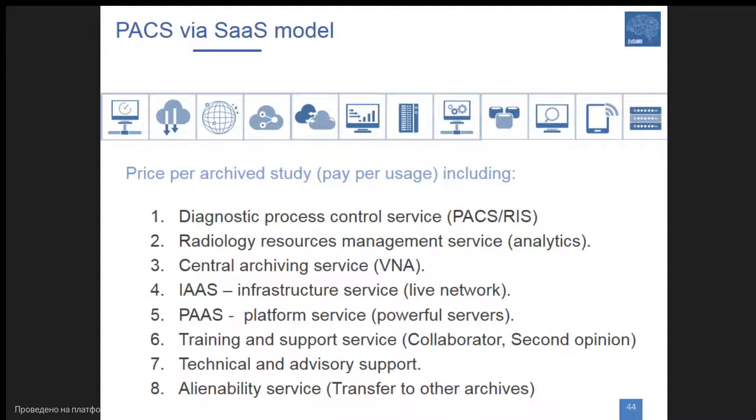With this solution, you put all the costs on the vendor and describe the end results and the aims, the scope of the service. You describe details and provide the details in the contract on which type and level of service you need to receive.